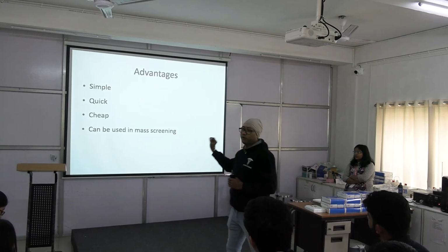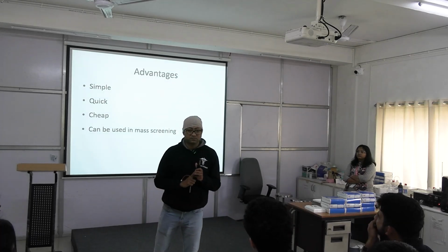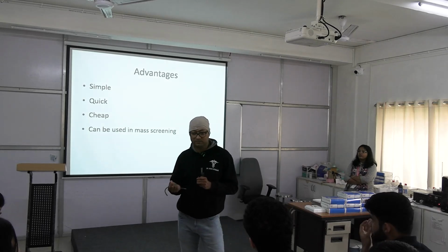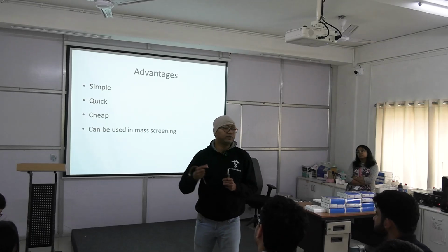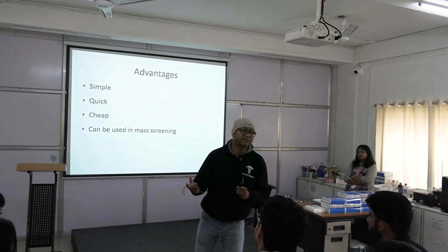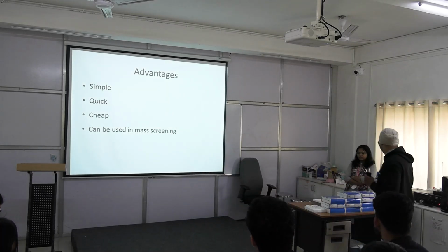Here is the point. So in the lab we will not use this, because in the lab we need exact hemoglobin concentration, okay? We need exact hemoglobin concentration. So to get exact hemoglobin concentration, you need a different method, and that is a modern method and much more scientific, okay? And it is costly as well. So what is the method?